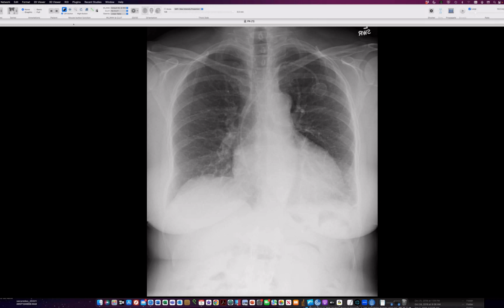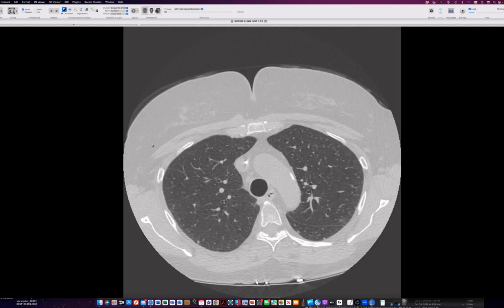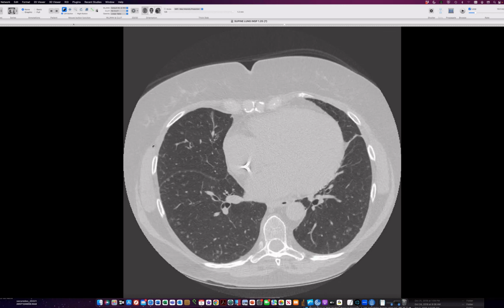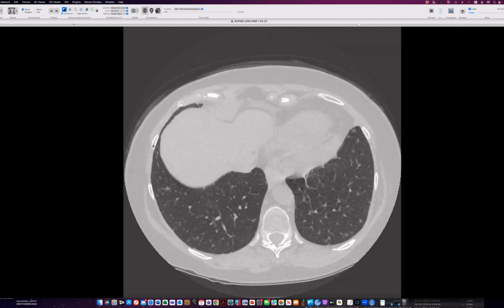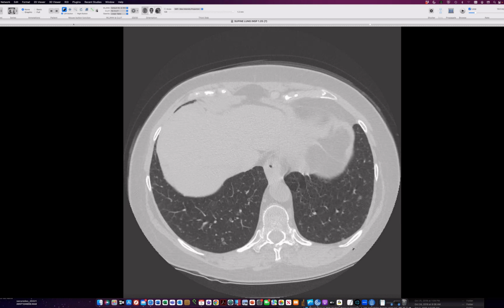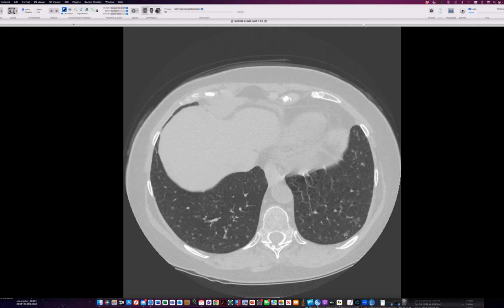And then it turns out that behind all of that, there was also this diffuse fine nodular lung abnormality. So we have a ton of small nodules, mostly peripheral, and somewhat more, I think, in the bases than in the upper lungs, but they're really involving all lobes. And some of these lesions have a hollow center, so there's some Cheerios involved here in terms of breakfast cereal. And for instance, here's a nice Cheerio down here. Here's a Cheerio over here.